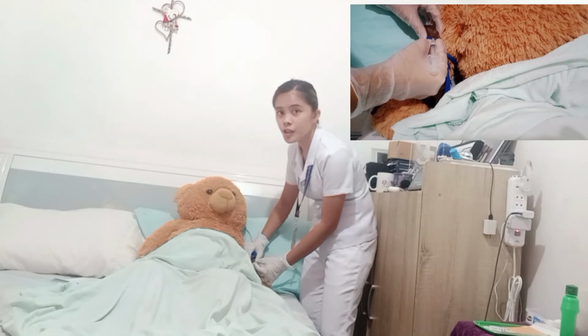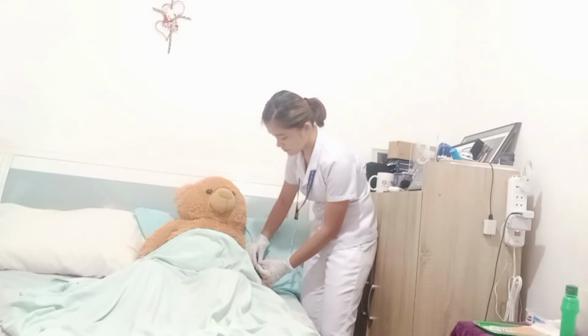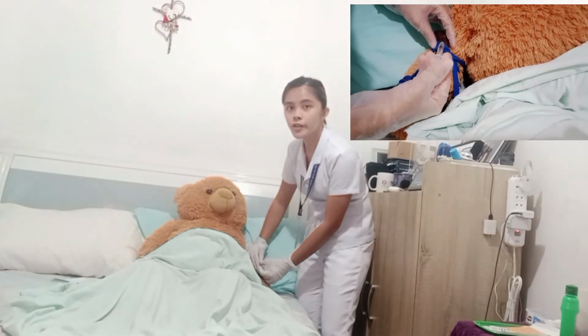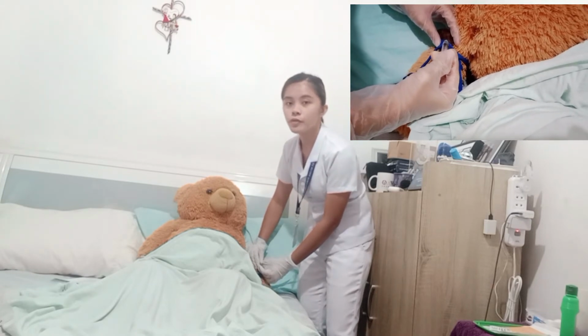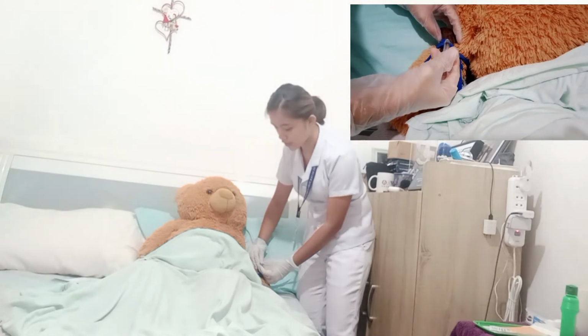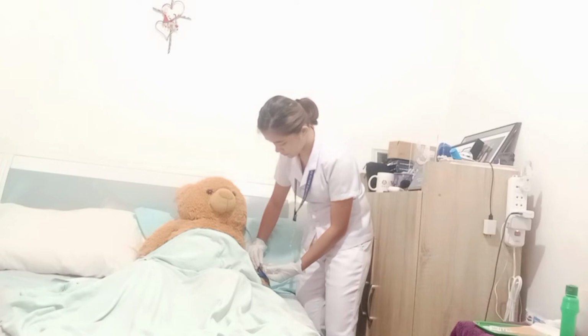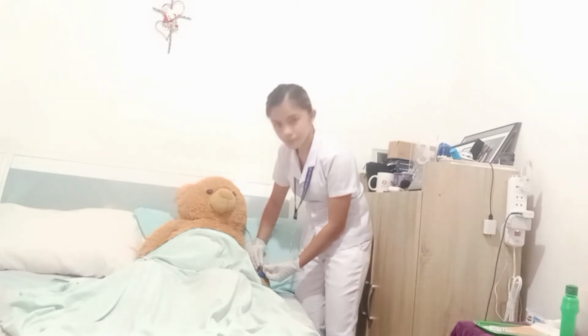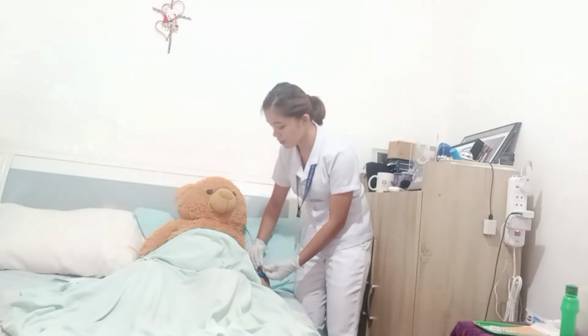Now release the pinch of the skin and rest your non-dominant hand on the patient. Now move the dominant hand to the end of the plunger and slowly inject the medication over several seconds. Now quickly withdraw the needle, place a swab or gauze pad on the site, and apply gentle pressure, but don't massage the area, to minimize skin tissue damage and patient discomfort.